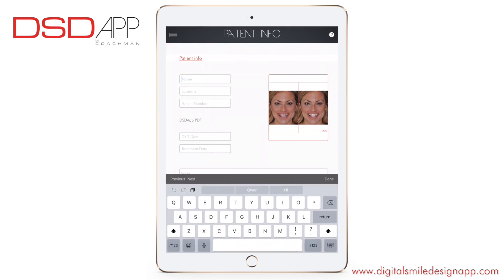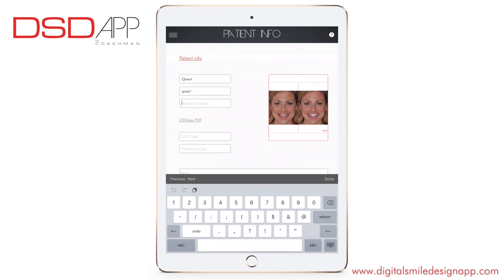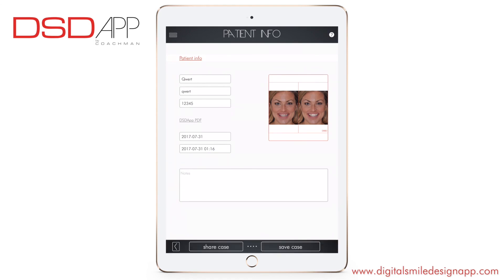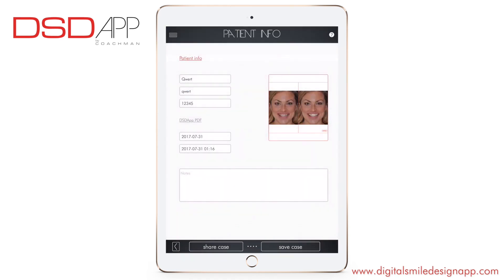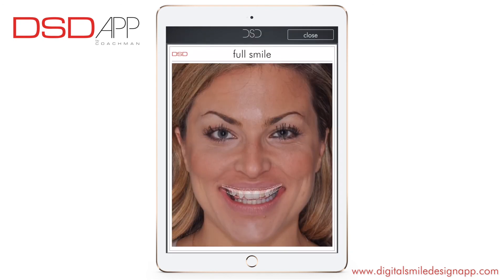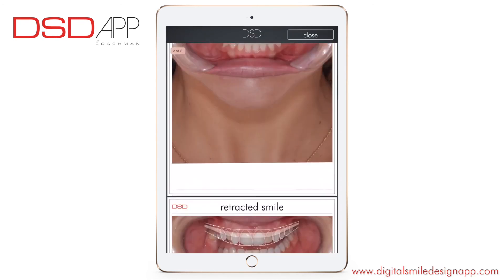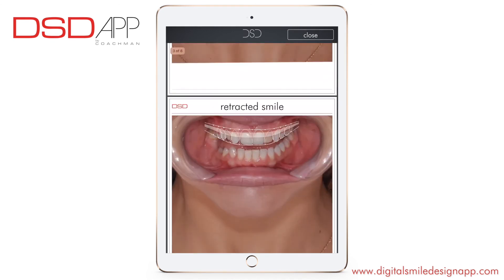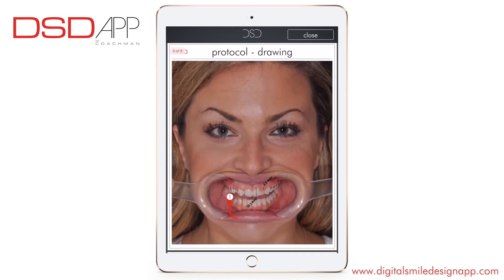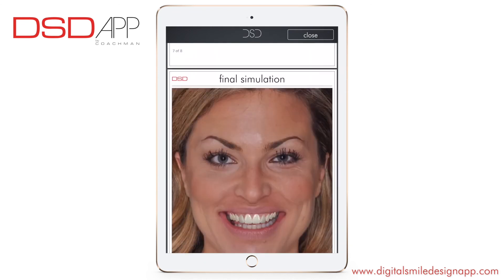Enter the name of the patient, patient number, and date. You can share the case — a PDF created with the smile design and the shapes is sent to your team by email. You can click on the DSD app PDF and view the PDF created with smile, frame, shapes, notes, measurements — everything.